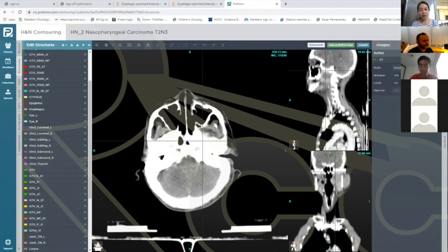So what is the tolerance of the parotid minus PTV? Is it the same? That's a great question. So there's really no difference in sparing.